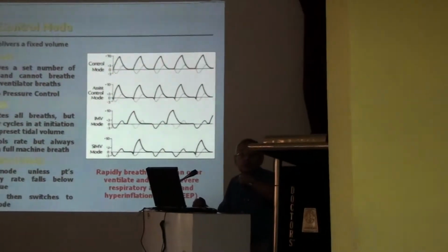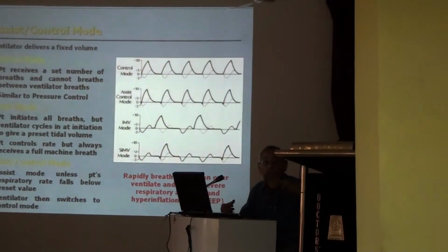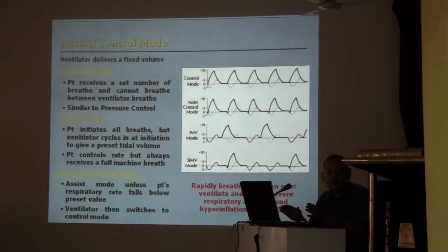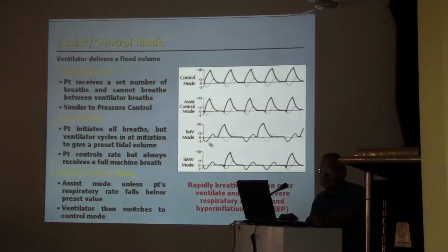I am taking respiration through the respiratory circuit. From one side the air is coming to me and it's going on. Now gradually it is declining. The watchdog now becomes alert. See this curve. This is a normal respiration.